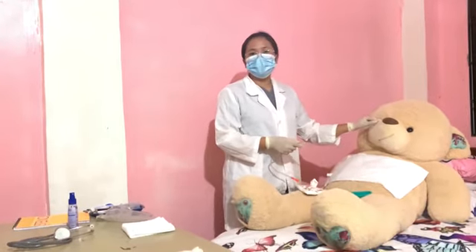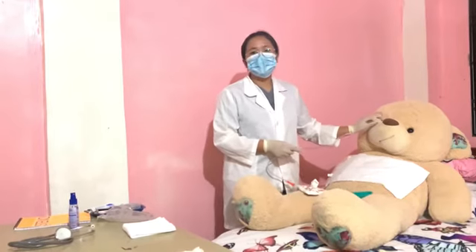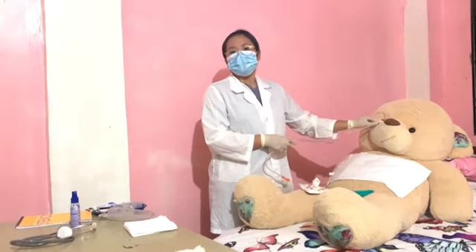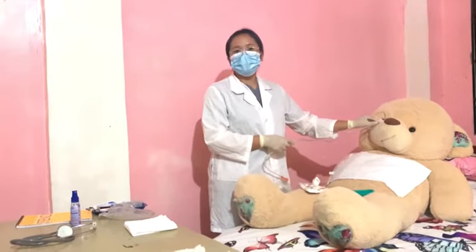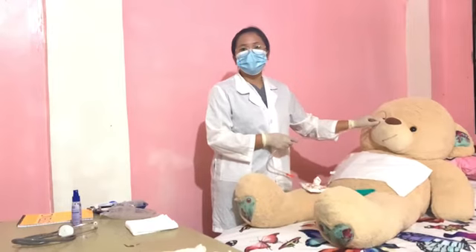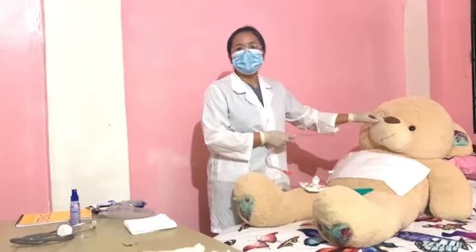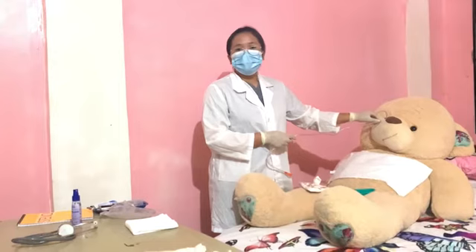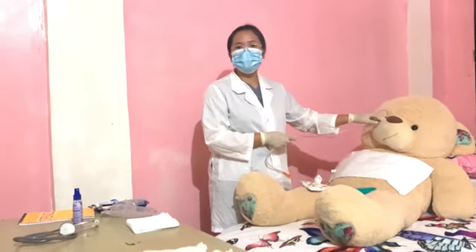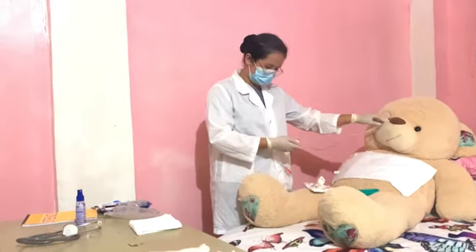And then stop when the patient breathes. If gagging and coughing persists, stop advancing the tube and check for placement of the tube with a tongue blade and flashlight. If the tube is coiled, straighten it and attempt to advance it again. And then keep advancing the tube until the marking is reached.